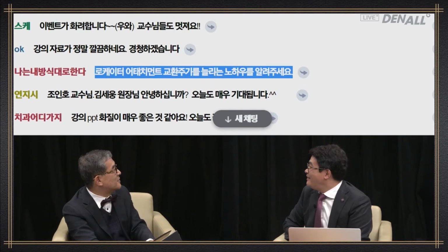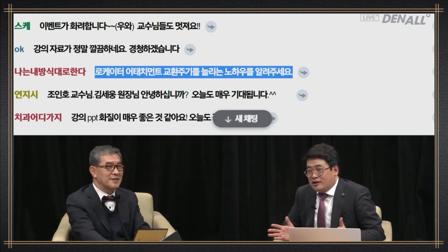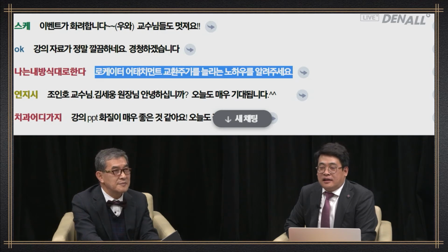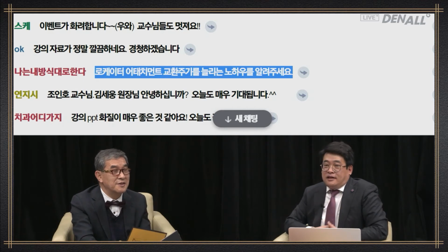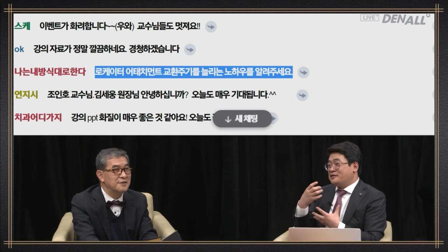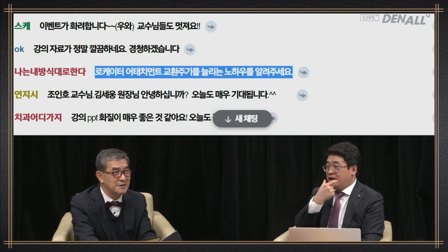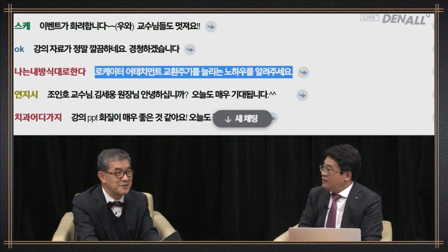How can I extend the cycle of replacing Locator attachments? I think the person is asking how I can use the nylon part long. When the patient puts on a denture, they should use their hands and put it in. That is ideal. However, most patients put it in like this, especially female patients. They put it in and they bite it and they put it in, and this can lead to deformation. Maybe they're not as good with their hands.